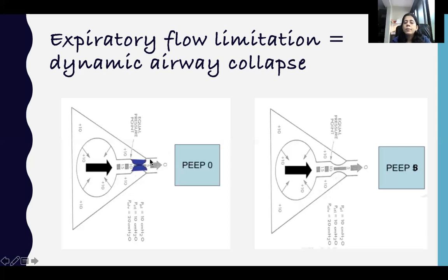As we give more medications, this obstruction may get relieved in certain alveoli, but in many it may not, and we may want to relieve it earlier. At this point is when we decide to give an extrinsic PEEP to open up this airway, so that it starts emptying with the next breath cycle. This helps us to homogenize the alveoli, that means it allows all the alveoli in the lung to communicate with the central airway. This is very important just before we are planning to wean these patients.